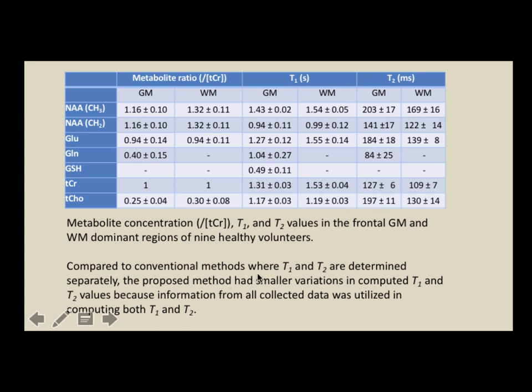Compared to conventional methods where T1 and T2 are determined separately, the proposed method has smaller variations in computed T1 and T2 values because information from all collected data was utilized in computing both T1 and T2.